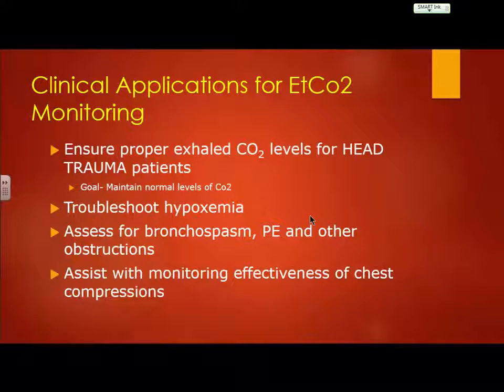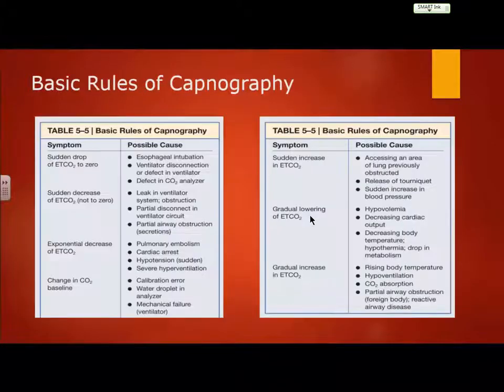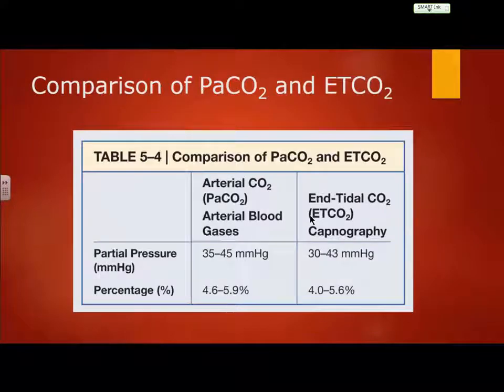Also, it can assist with monitoring the effectiveness of chest compressions. This is probably one of the most important aspects of CO2 monitoring. Cardiac arrest management, have that end-tidal CO2 monitor on, watching it. It'll give you indication of good chest compressions, good ventilations, but it also can give you indication of return of spontaneous circulation. How? Well, let's wait before I ask that, all right? This is what I was talking about earlier. There's not a huge difference between your arterial PaCO2 and your end-tidal CO2. There's not a huge difference between the two, all right?